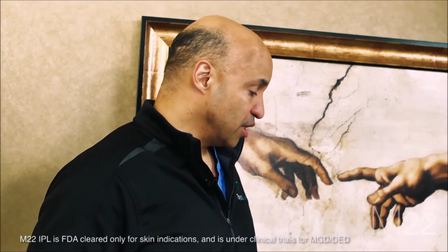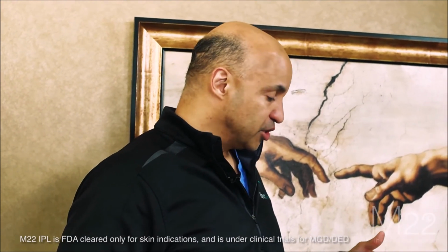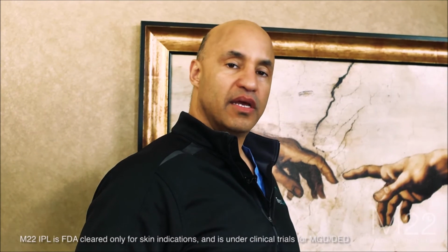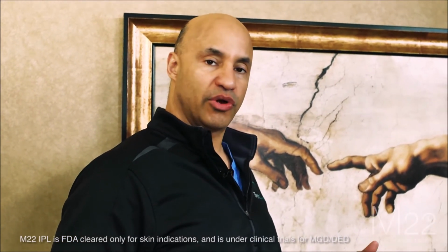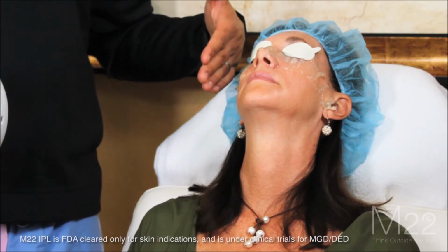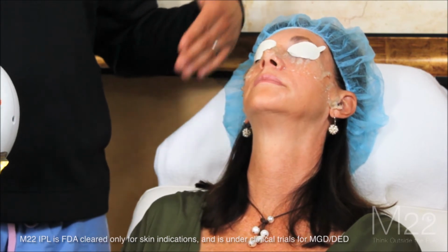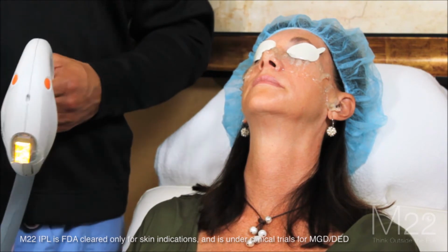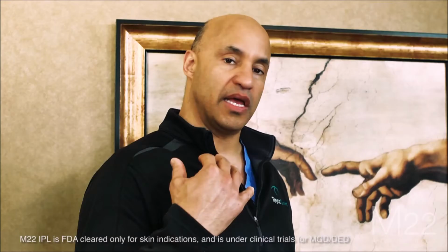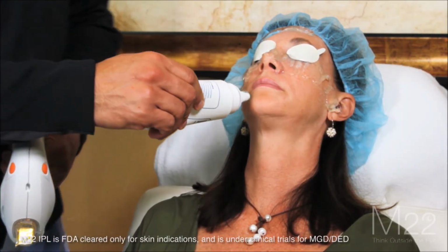One of the advantages that the patients will see with IPL is not only will it help their ocular surface, but it's going to help the skin where you're doing the treatment. So you're going to get some facial rejuvenation where you're doing the IPL. Now some patients are going to ask you, well, I love the way my skin looks where you treat it, can you treat the rest of my face? And if somebody wants a full facial intense pulsed light treatment, IPL treatment, we're going to do a 1 pass in the parts that we didn't get.